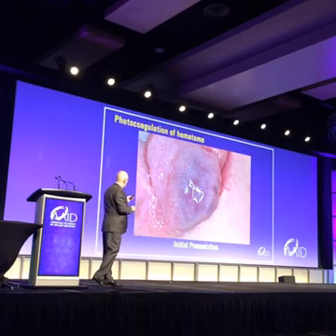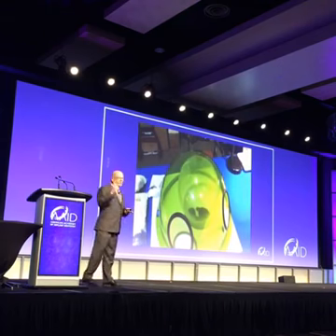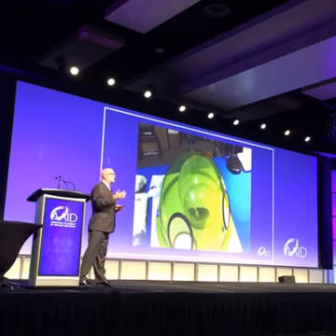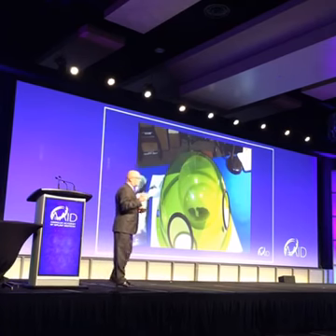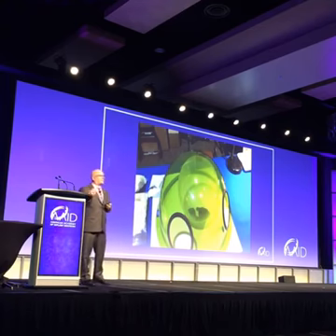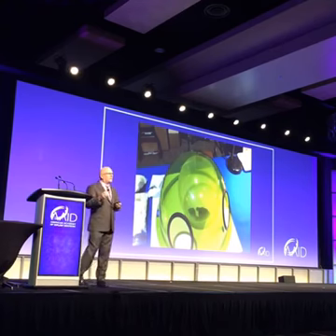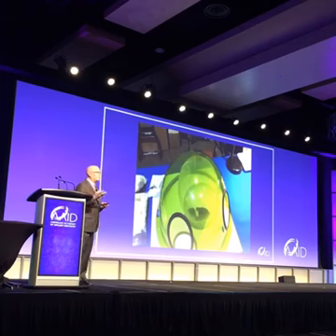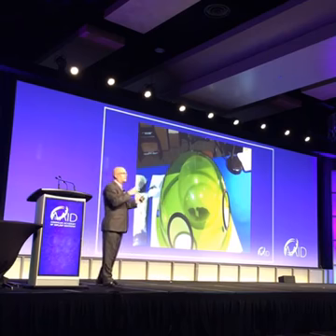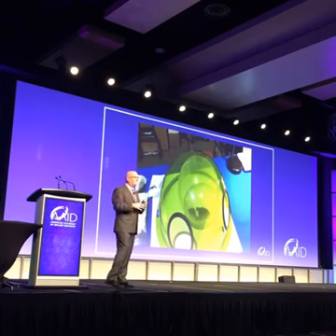So I'm going to go back one, because I think one of my slides is missing. But let me talk a little bit about where things are absorbed. Erbiums are highly absorbed in hard tissues, like hydroxyapatite. It's also highly absorbed in water. What are we mostly made of? Water.